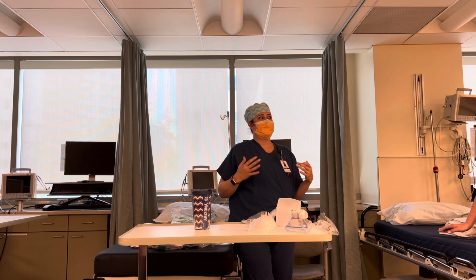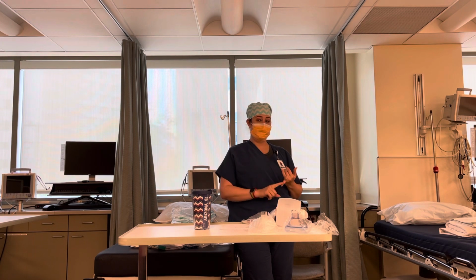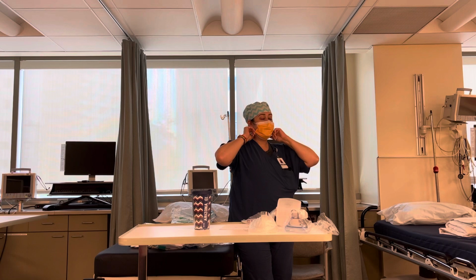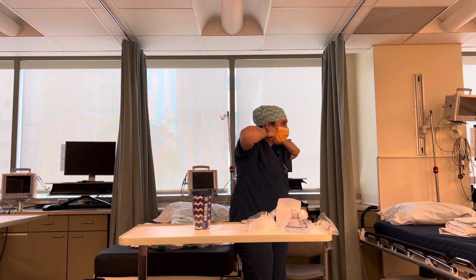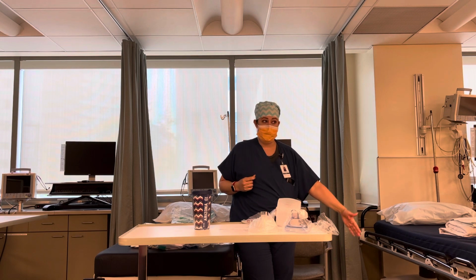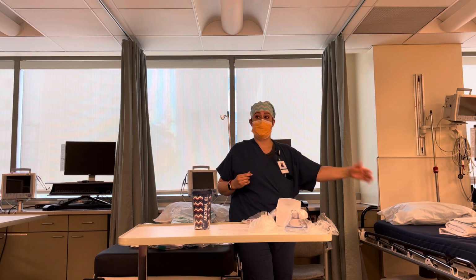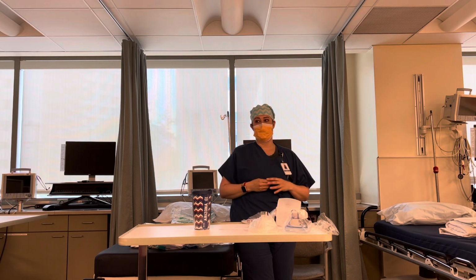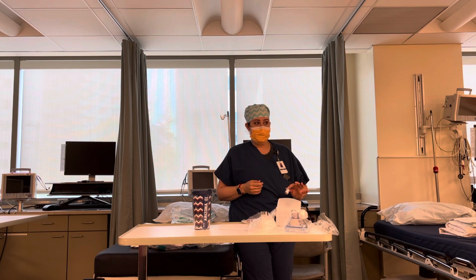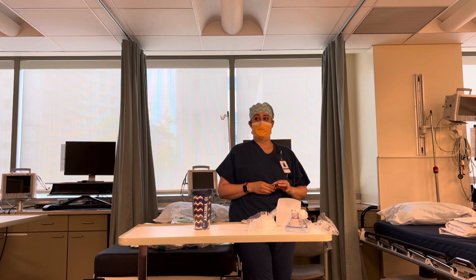It sounds like that is what Julie had planned on doing if she were to give it, but we were able to break it. Like 99% of laryngospasms you can break with positive pressure, with that Larson maneuver you'll see us do where we push back here and do a real solid jaw thrust, or with deepening the anesthetic, give them more, which seems weird, but you want to relax them more to break those cords open. So we did not give the roc yesterday, but I did run and get mine and drew it up, but we broke it without it.